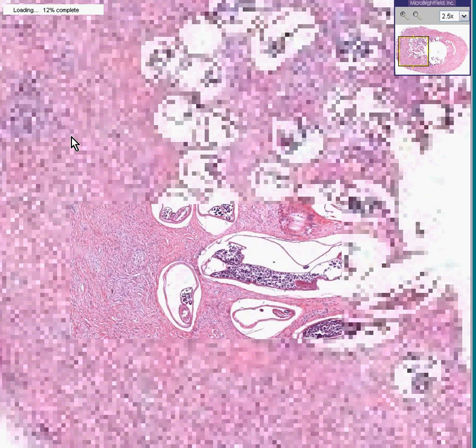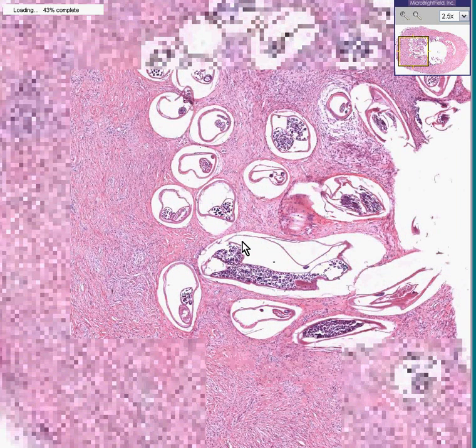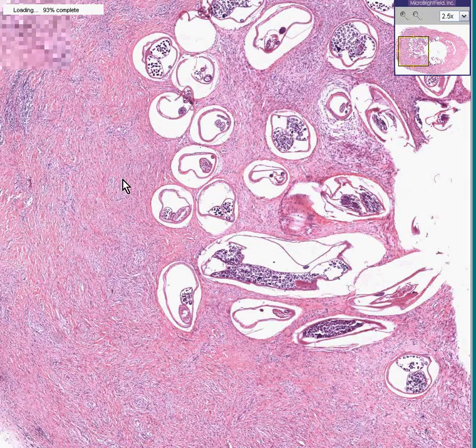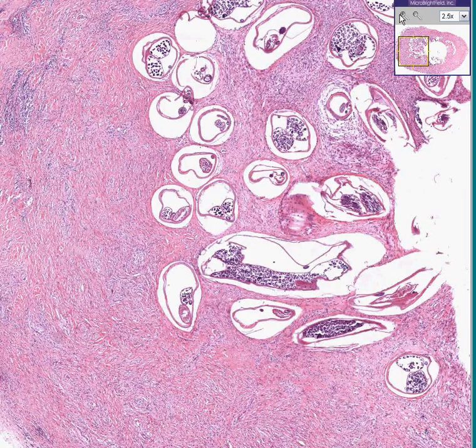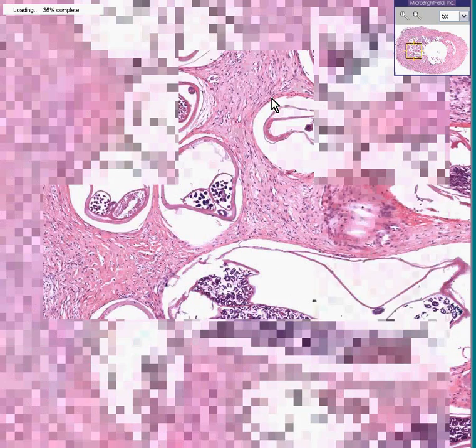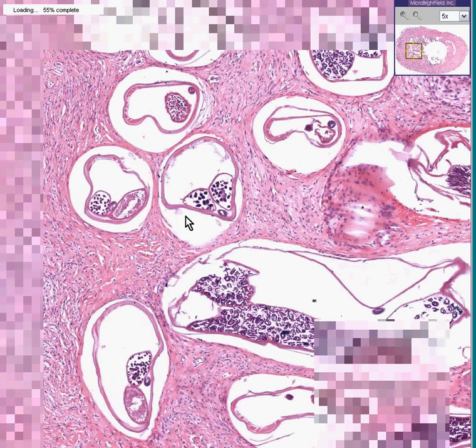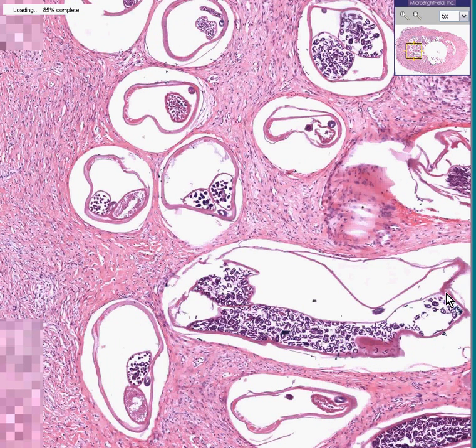You're dealing with structures towards the center which once again do not look like they are part of any normal human tissue that we've ever seen. They appear to be cut and showing round on cut sections, long on longitudinal sections.